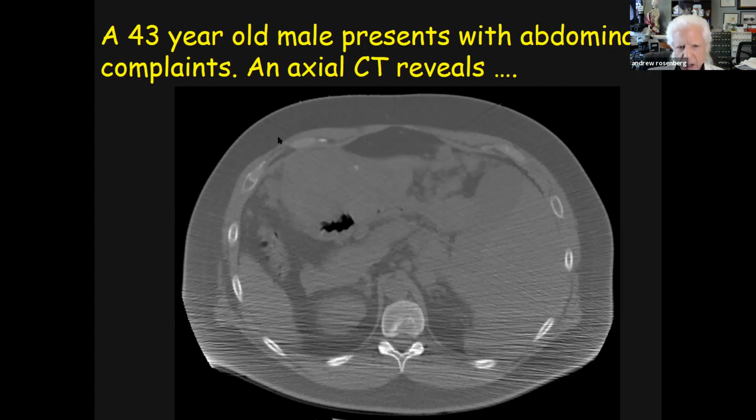We are looking at a cross-sectional CT scan of the body, and this black structure represents the lumen of the stomach. And we can see that the wall of the stomach is markedly abnormal, and the radiologist is very concerned that there is a neoplasm that has resulted in ulceration of the gastric mucosa and bleeding. The surgeons recommend that this mass needs to be removed from the patient.